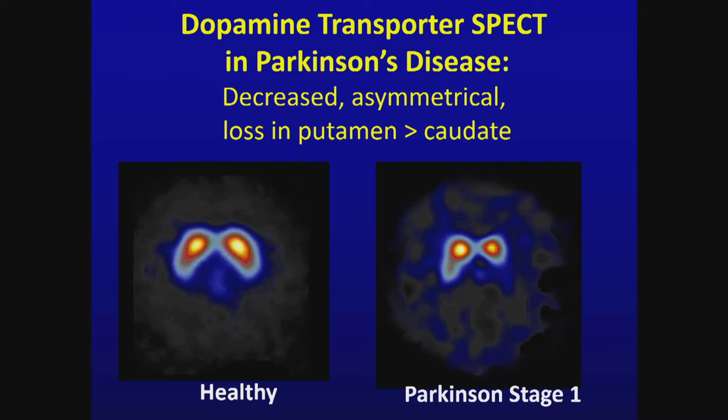Well, this can be used and is actually approved to be used to aid in the diagnosis of Parkinson's disease, to distinguish those two conditions. It was approved first in the European Union and then here. And it can be used to get a more homogeneous group of individuals for this putative neuroprotective treatment of Parkinson's disease. It's going to have people with Parkinsonian symptoms plus an abnormal scan showing loss of dopamine transporters. And it has been used for this purpose.